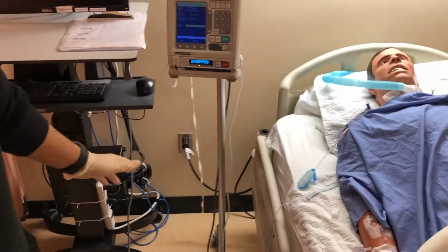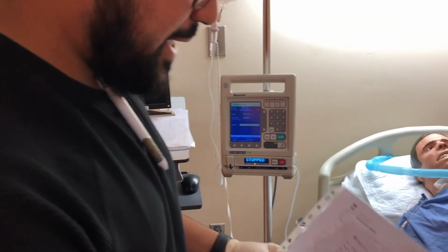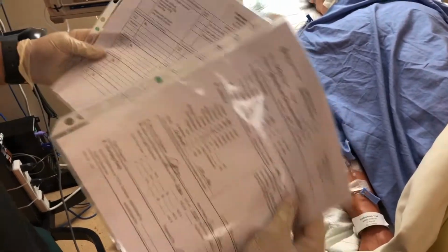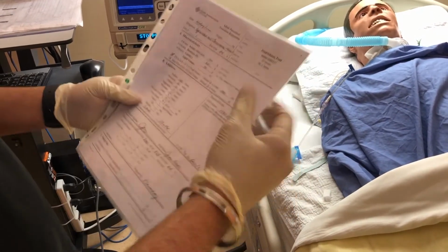And before I start this pump, I want to do my third check, and this is a third check that needs to be done with another RN. So I'd have another RN come in with me. We would verify that we have the correct patient. So we have Fred Fredrickson. The MRN is 099-0127 on both the requisition and the MAR. We can ask the patient to state the name. He states the name, Fred Fredrickson, and that's good to go.